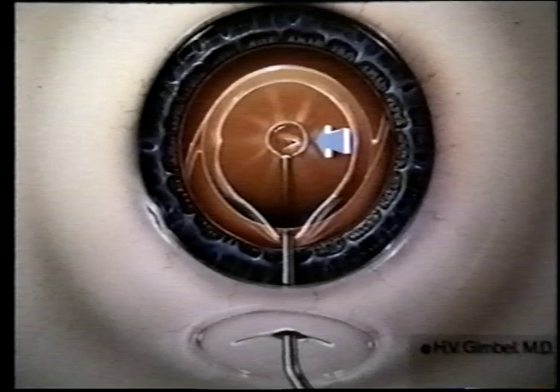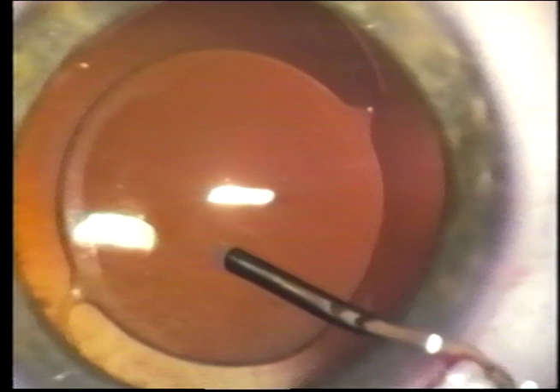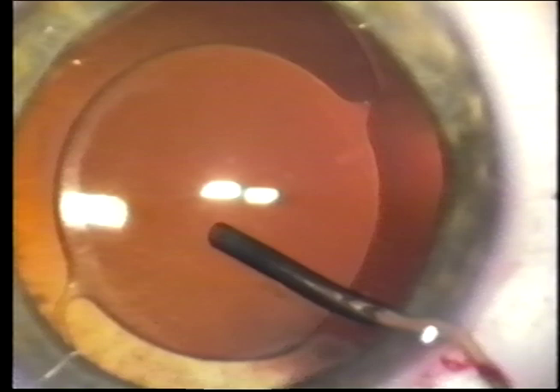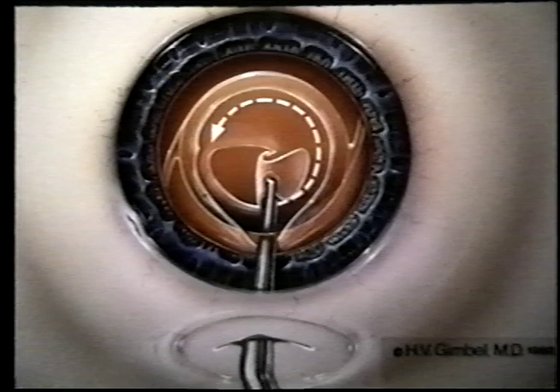Again, the PCCC is accomplished using capsulorexis strategies, starting with a small puncture, adding viscoelastic to push the vitreous face away to try to maintain an intact vitreous face. I have used Healon or Healon GV to have as clear a view as possible. And here, some viscoelastic is being added to push the vitreous face away before extending the tear beyond the central puncture.